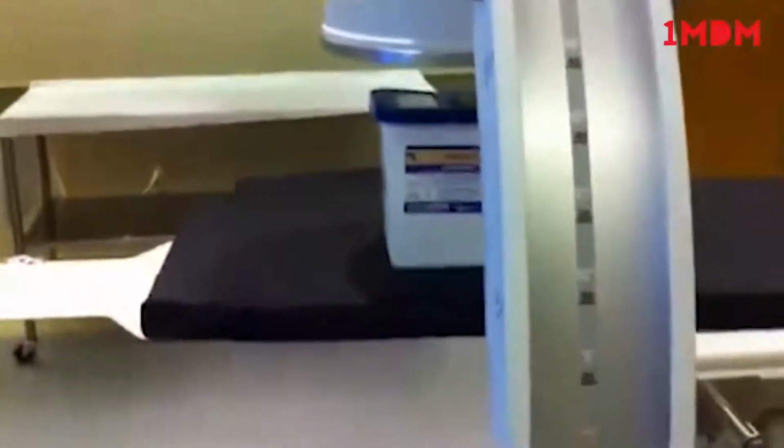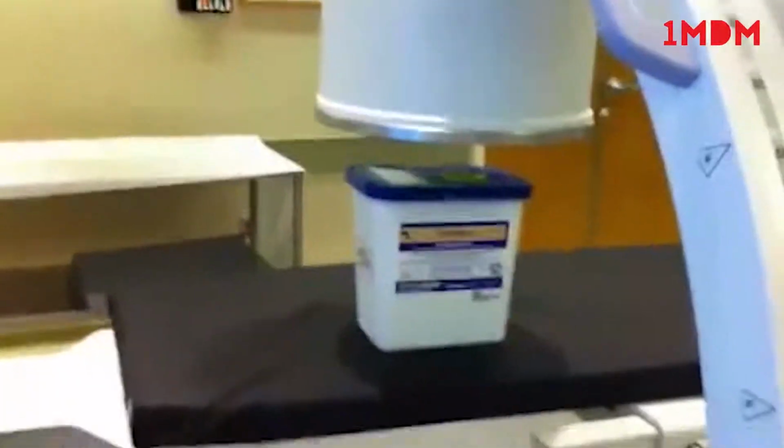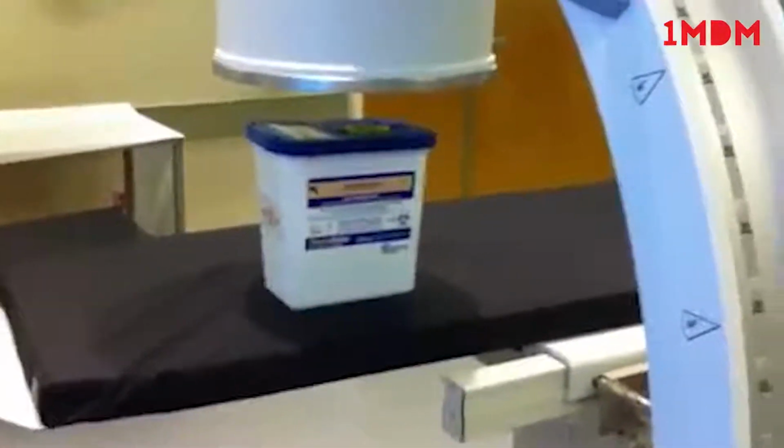All right. So here we go. Now I want to center this a little bit better, because from the angle where you're standing normally as a tech, or in this case even a student, you can't really tell that this thing is centered properly. Because if you come over here, it's not. So instead of taking the lock off here and trying to drive the C-arm forward towards the table, I usually don't recommend that, because you can wigwag the whole machine by pushing it forward. These two wheels move independently of each other on each side.